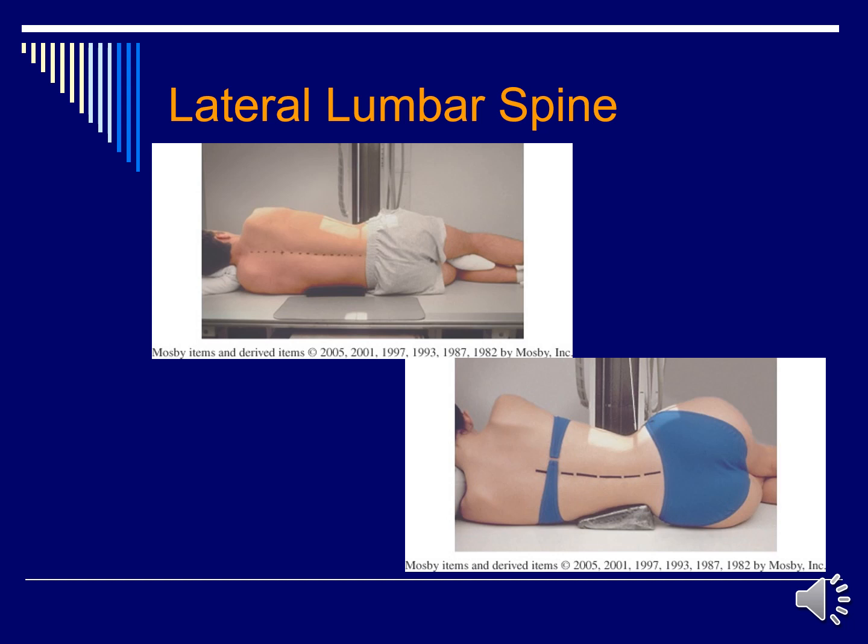Make sure that you use your left marker as this is a left lateral, and we always mark the side for the lateral that's closest to the IR. You can put that in the front or the back of the patient, although it usually shows up better when it is placed anteriorly versus posteriorly. This is going to be done on suspended respiration, and make sure that you shield the patient appropriately.